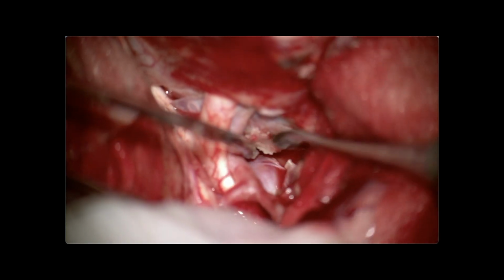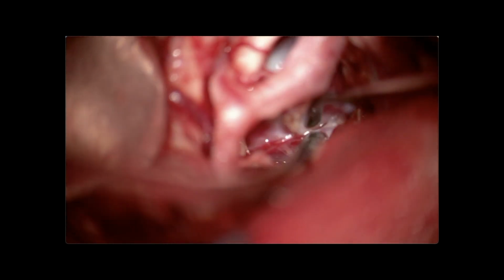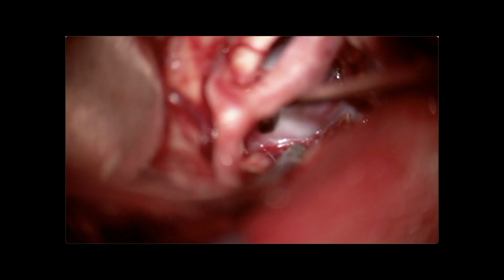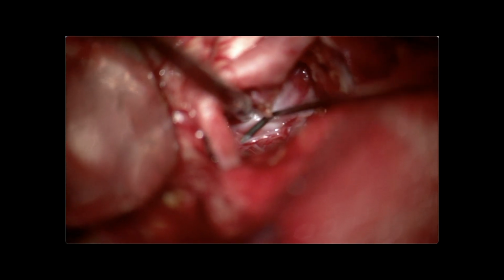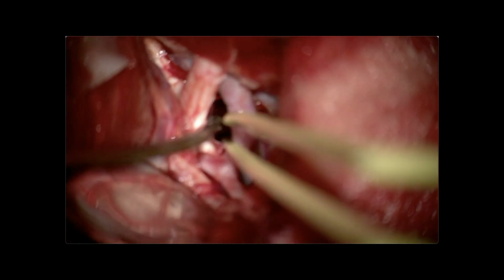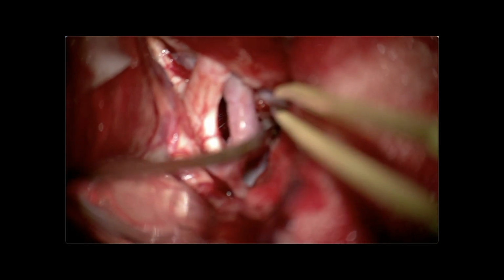The next stage is direct visualization and dissection of the critical thalamoperforating arteries that are stretched on the dome of the aneurysm. All actions should be aimed at preventing damage to these critical perforating arteries, as this can lead to severe ischemic damage of the thalamus.